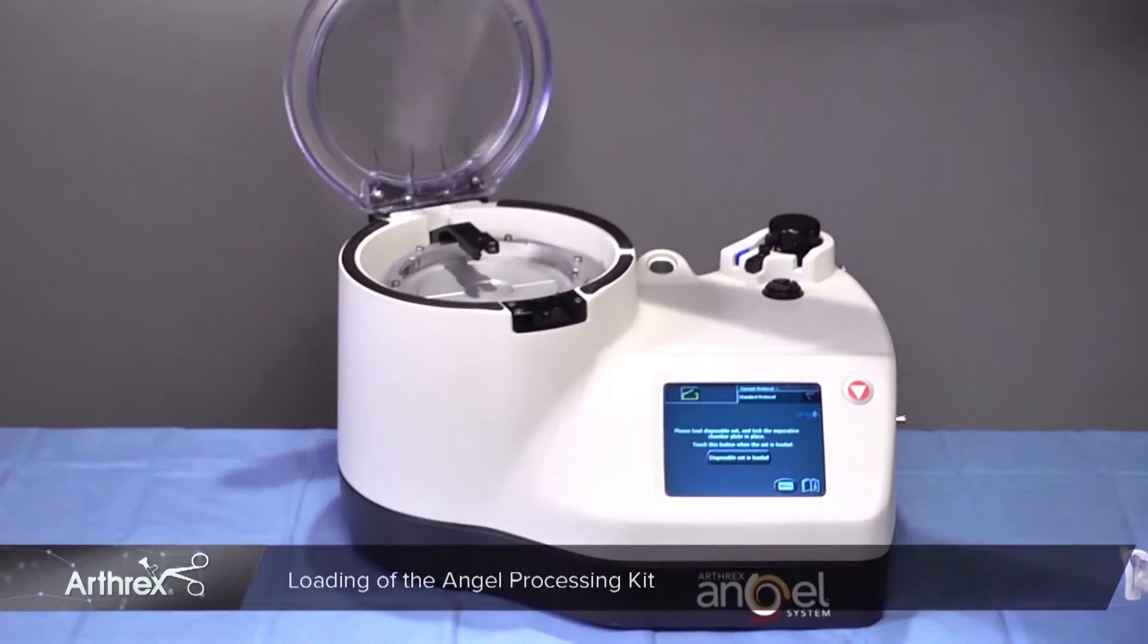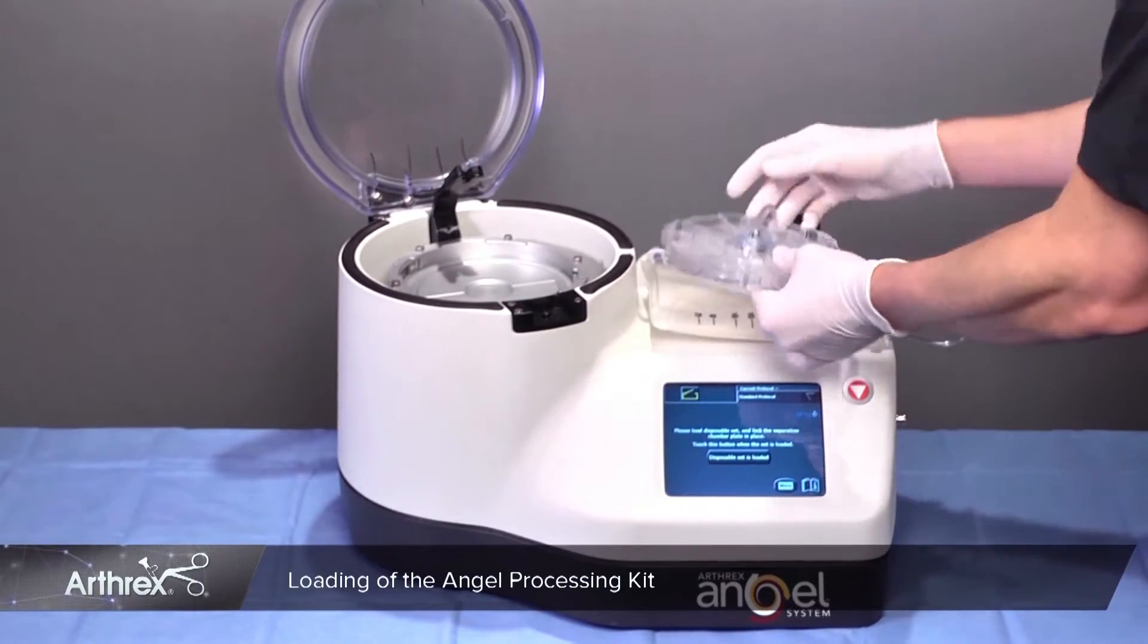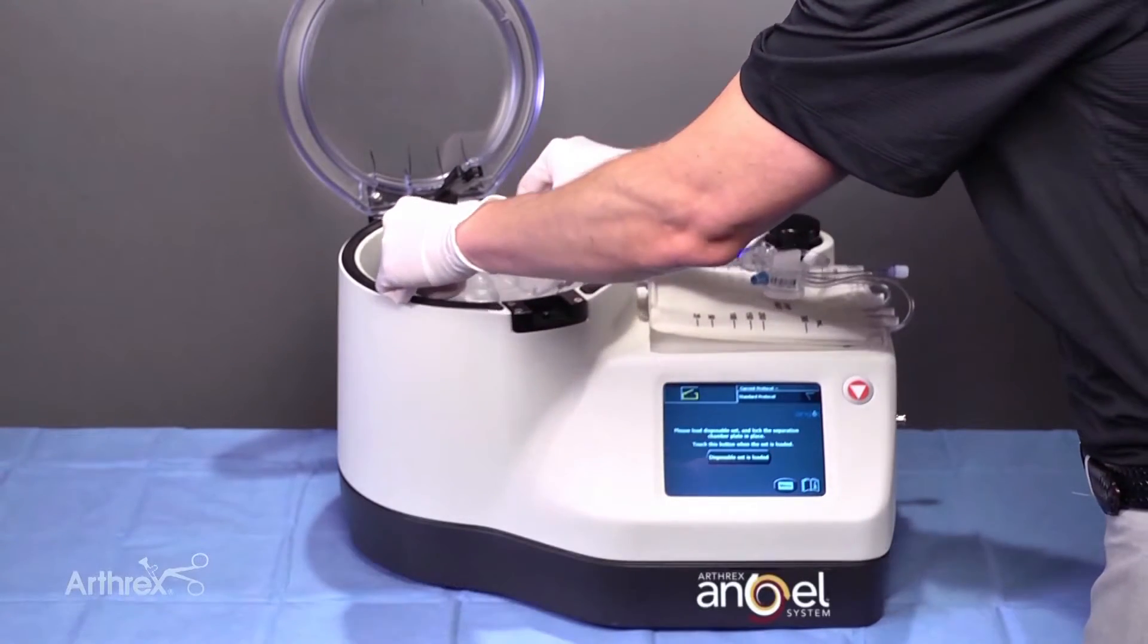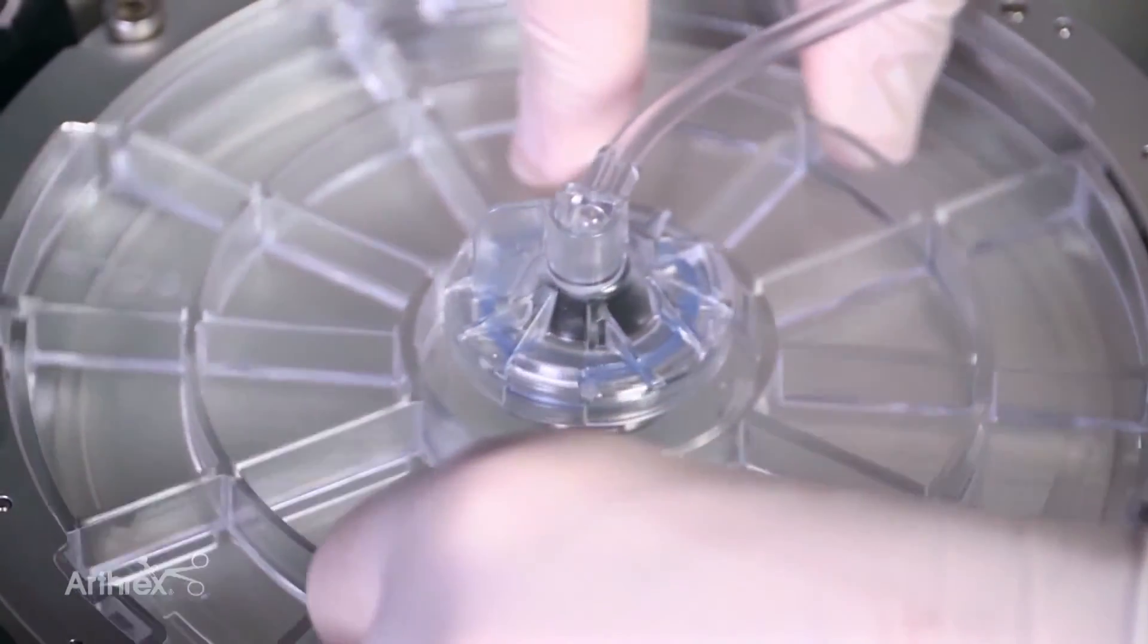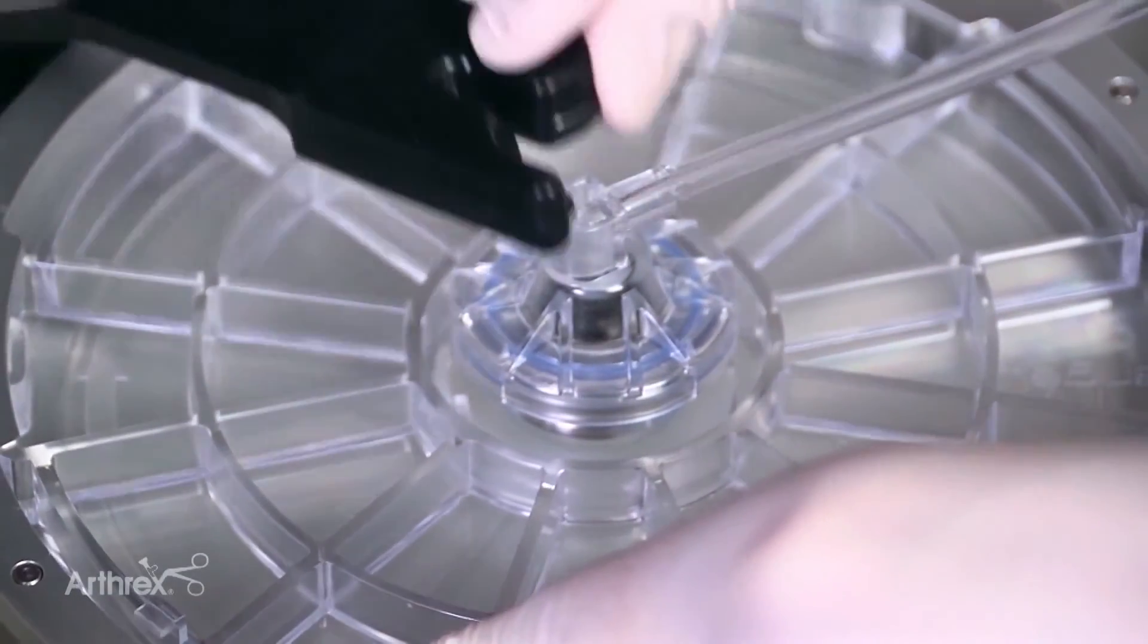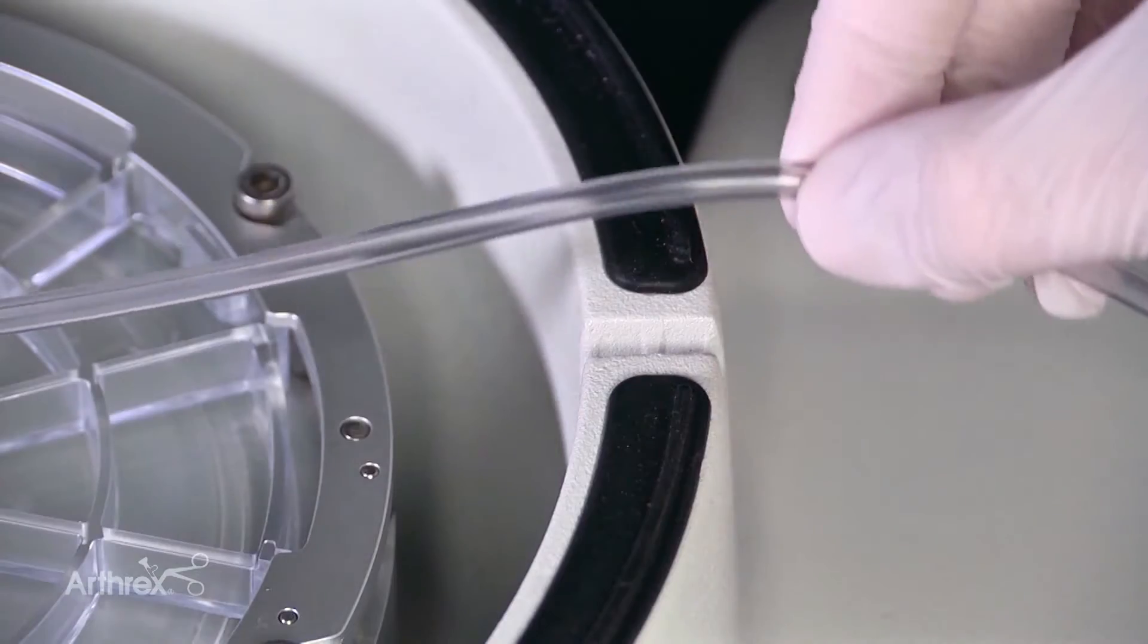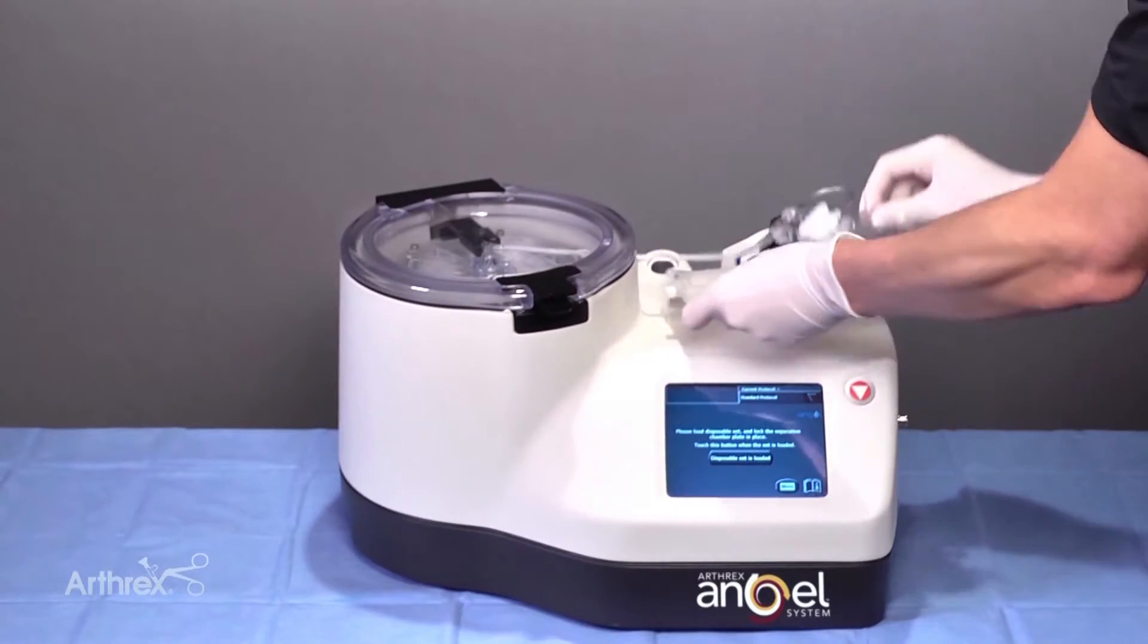Begin by opening the centrifuge lid and lift the centrifuge stator arm. Insert the separation chamber into the centrifuge adapter taking care to align the notches on the centrifuge adapter. Turn clockwise until the safety wings lock. Lower the centrifuge stator arm. Place the tubing in the centrifuge well slot. Close the centrifuge lid.